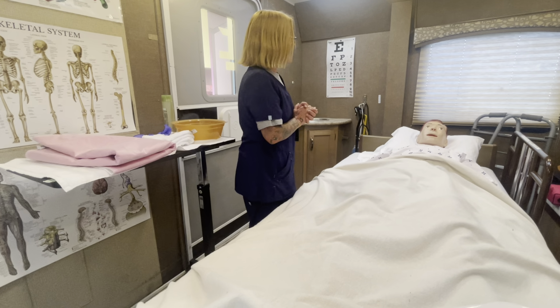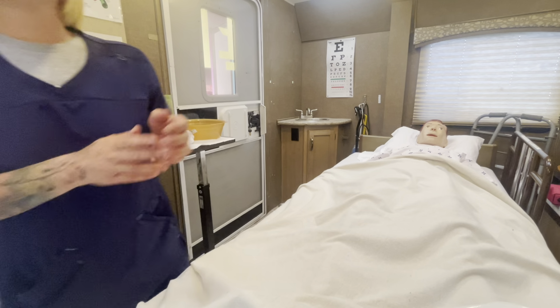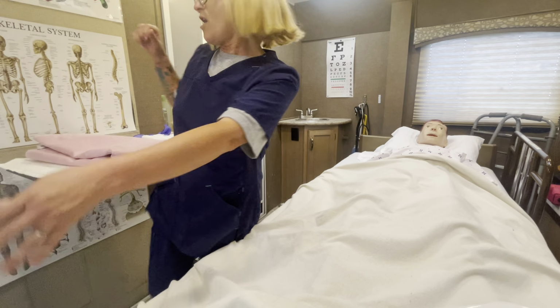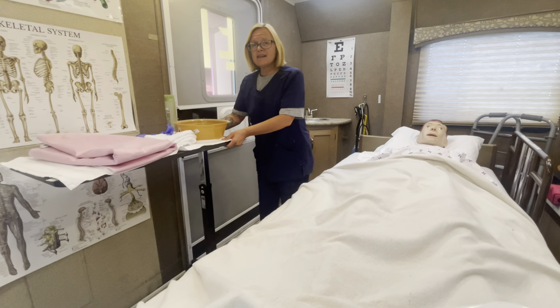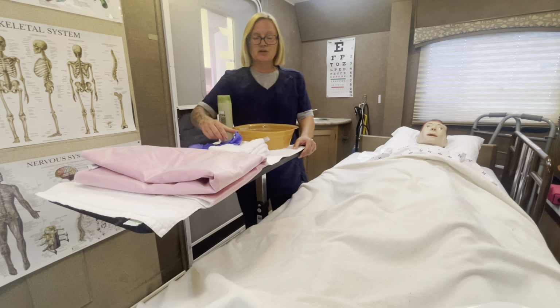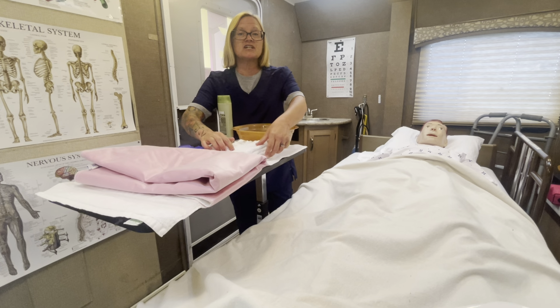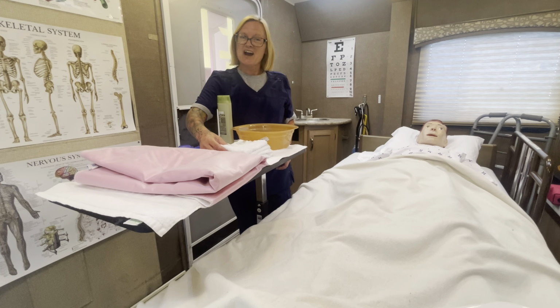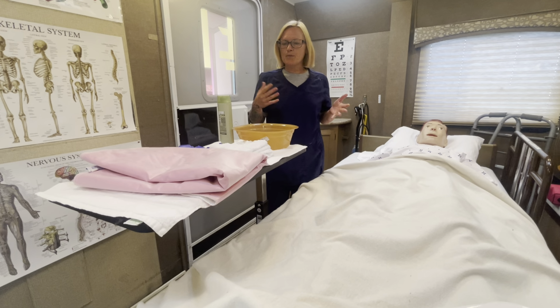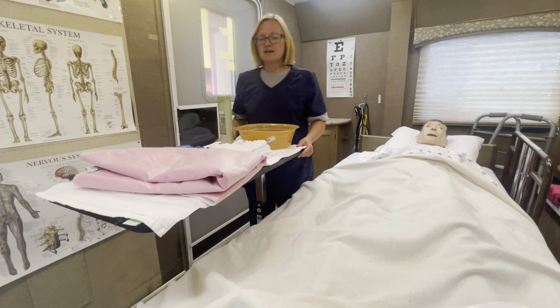All right, I'm going to gather my supplies and I'll be right back. So I'm going to go out of the room. I'm going to wash my hands, knock on the door, provide my privacy. And now I have my supplies. For cleaning a urinary catheter, you will need 1 pair of gloves, 3 washcloths, 1 for washing, 1 for rinsing, and 1 for drying. And then you'll need a peri pad or a Chuck's pad, which is more of like a paper pad, and a water basin and soap so that we can clean the area.